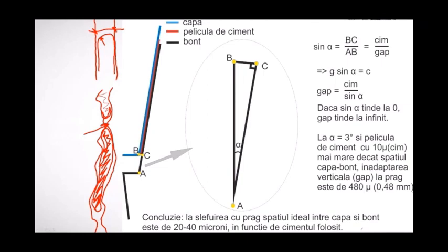that's it. The thinnest cement seems to be the glass ionomer, like 15 microns is the thinnest. The resin cements vary from 20 to 40 microns. And imagine that your impression was taken in a compressive way, and your abutment is already smaller. Your die in the lab is smaller than the abutment in the mouth because the impression was compressive. Then you have to give even more space, right? So all these things have to be taken into consideration.